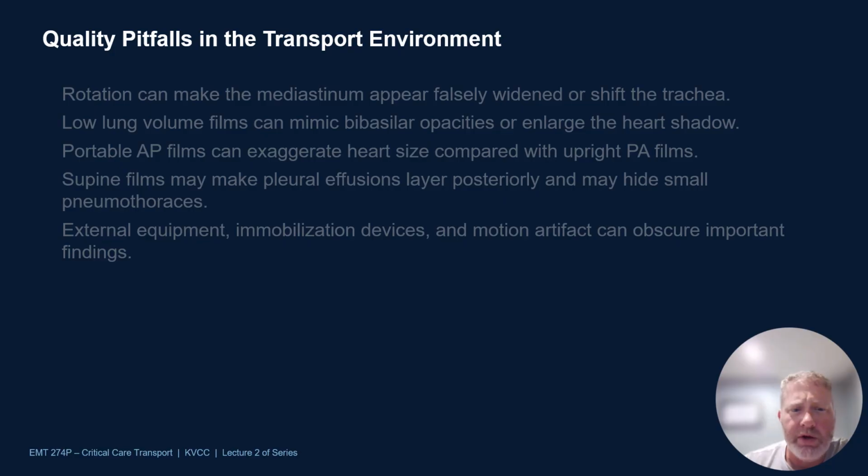So, quality pitfalls in the transport environment. What happens if the patient can't take a deep breath or is rotated kind of funky on the backboard? There's always technical limitations that are part of the interpretation that you can't ignore. Depending on the rotation, it can make the mediastinum appear really wide. It can shift the trachea.